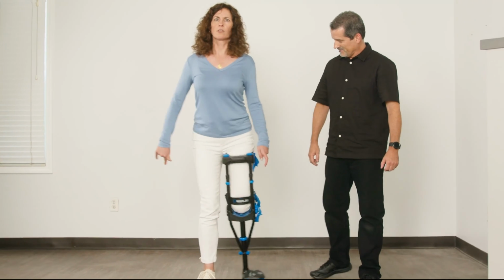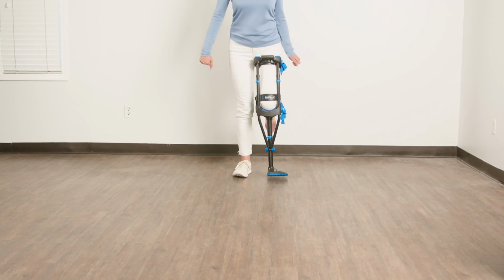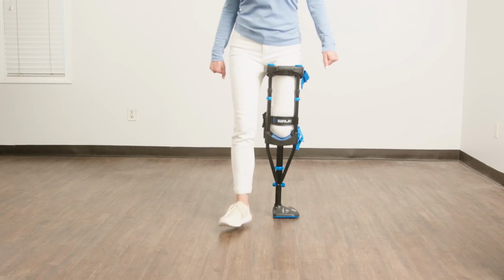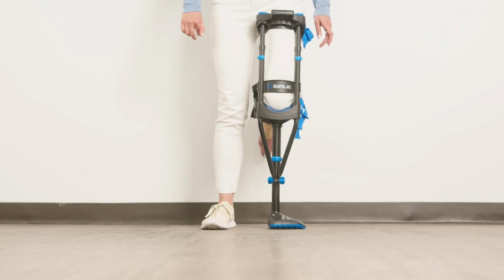Remind the patient to commit their full weight to the crutch when the good leg is in swing phase. You can also instruct them to imagine that they are pushing down on the crutch as hard as they can. Then lean forward and step through.